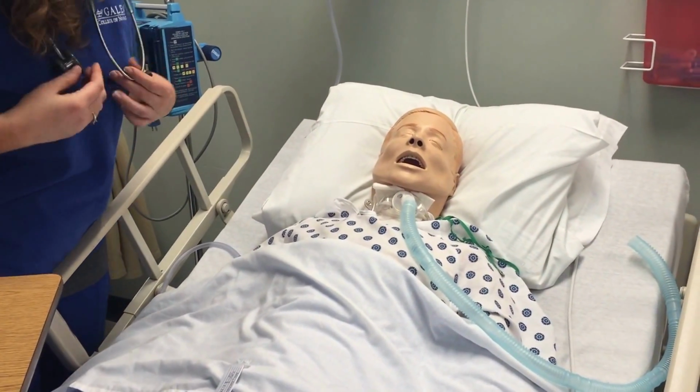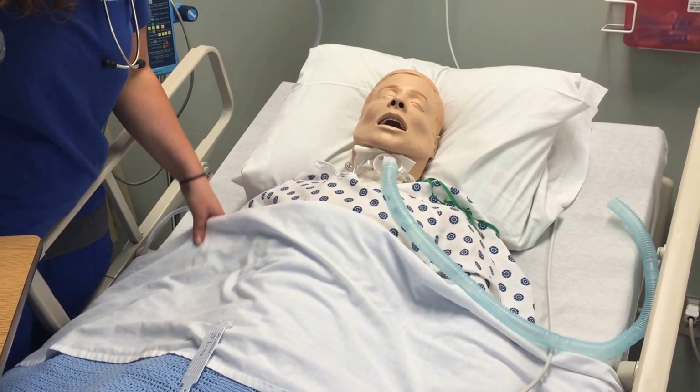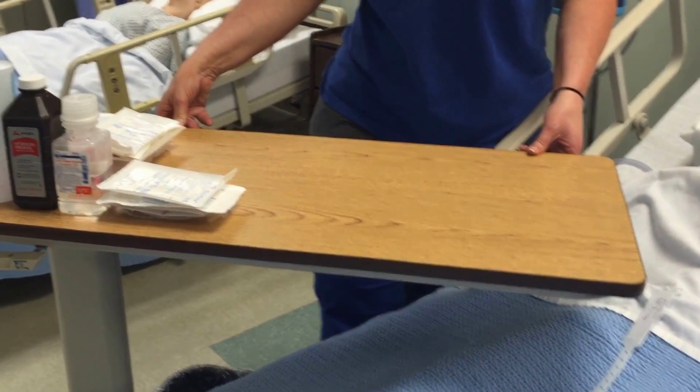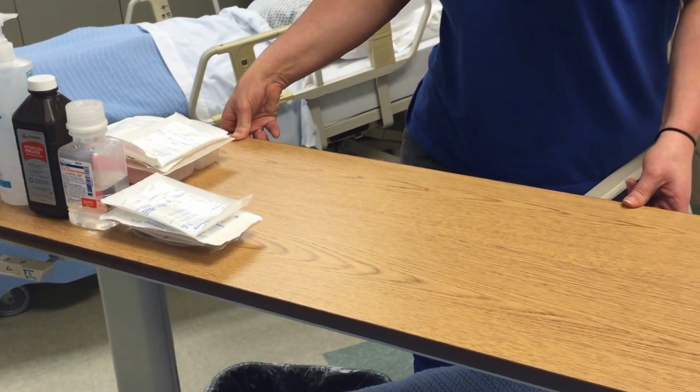All right. Sounds like you almost need some, we need to do some suctioning on you, so we're going to do some suctioning. I'm going to set that up and get ready for that, okay? All right, so to make it a little easier for everybody involved here, I want to make sure my trash can is right here by my foot and ready.